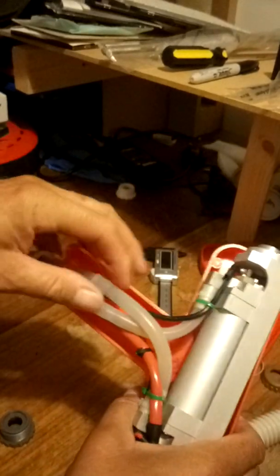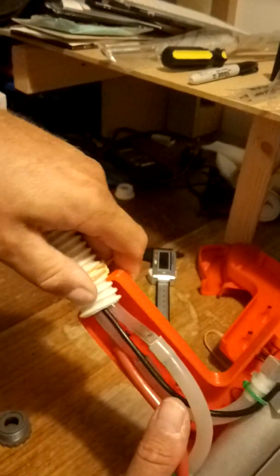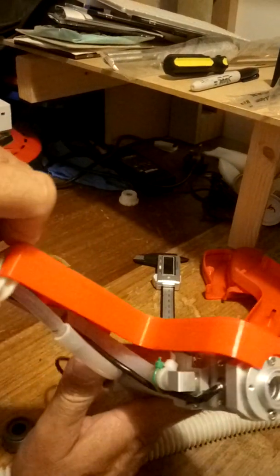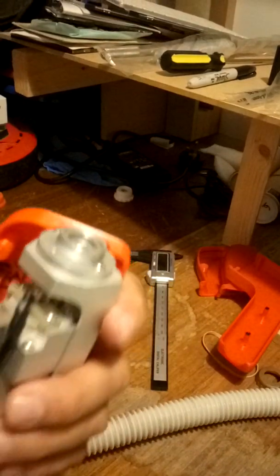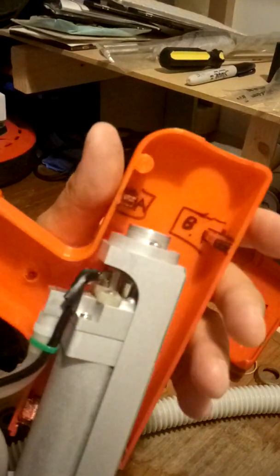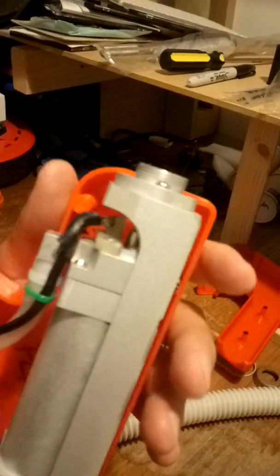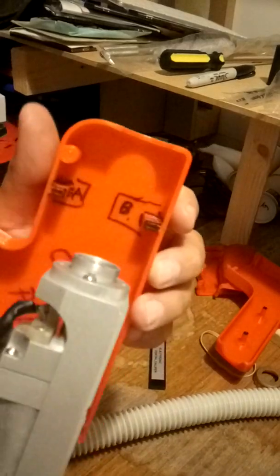These obviously go down there like that. That traps in there perfectly. That's really good. In fact, I didn't expect that to work so well. That's really good. But here, right now, I'm managing to get that out of there, like that, okay, but A and B just seem to be getting in the way, so I may have to remove one and then the other.